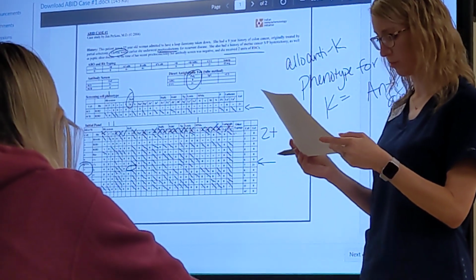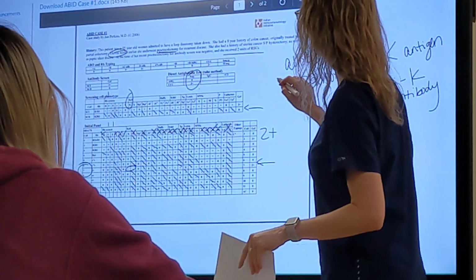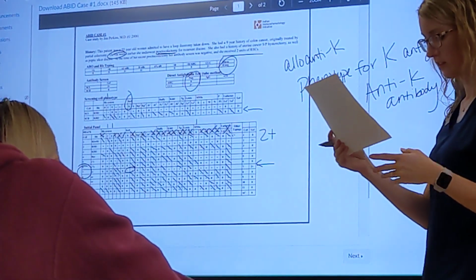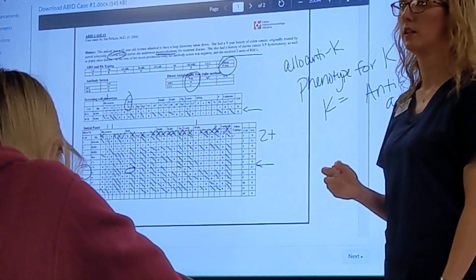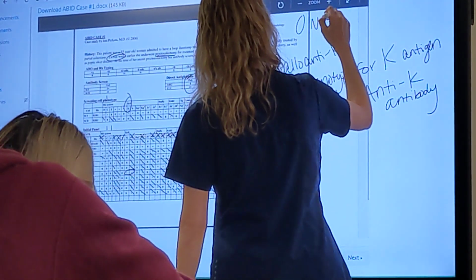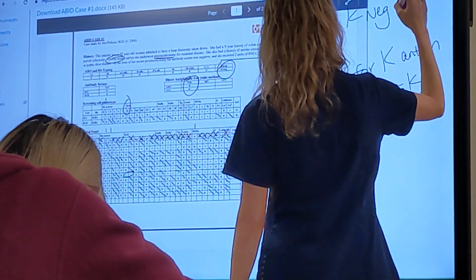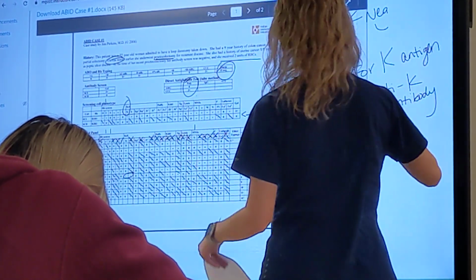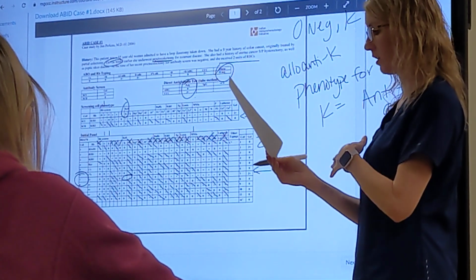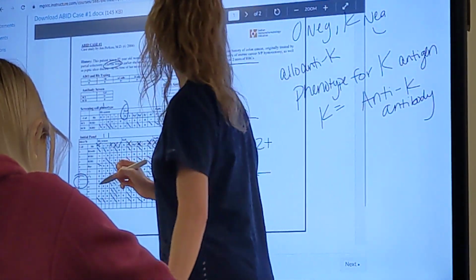So how would compatible blood be found for this patient? She needs O negative units, because she's O negative. And what else do they need to be negative for? They need to be negative for the Kell antigen. Is Kell negative a very particular part of the population? 91% of white donors, 98% of black donors are K negative. Oh, so it's a big part of the population.